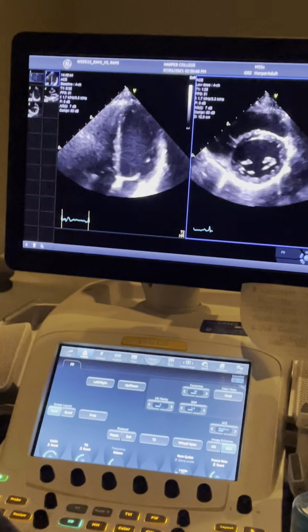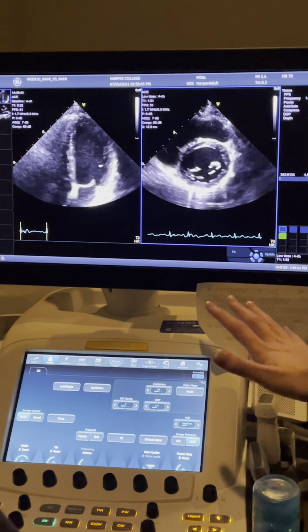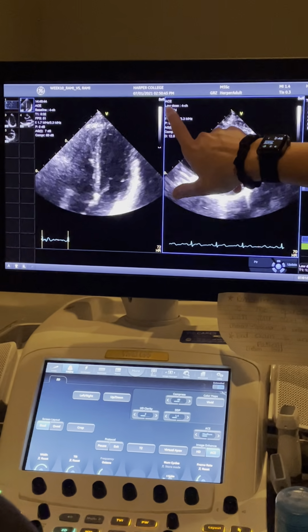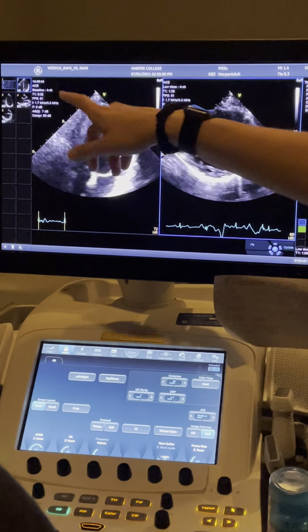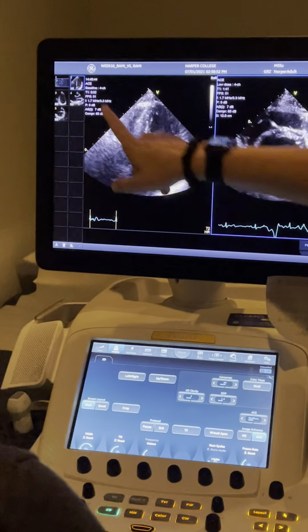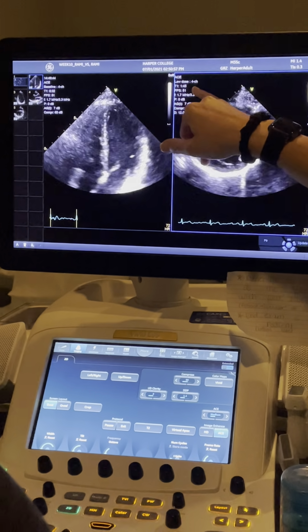Everything is so pretty. Okay, so now what it does for this machine specifically is you're live on this side because it wants you to go into acquiring low dose. So that's why you're seeing short because your probe's down, you're live. Over here, it's pulling that clip that you acquired of your baseline 4-chamber. It now wants you to get your low dose 4-chamber.